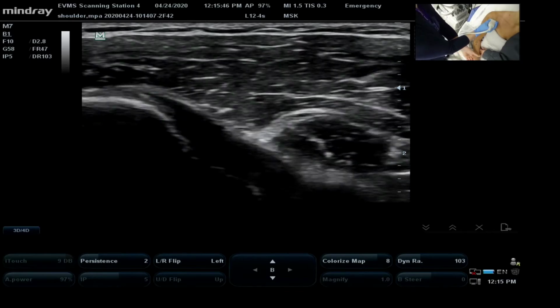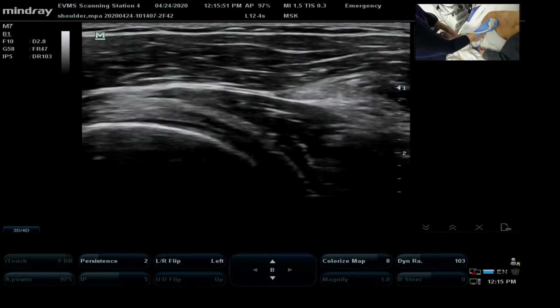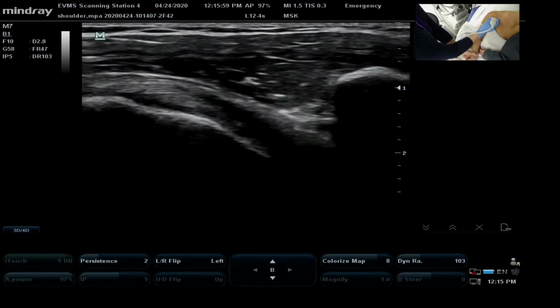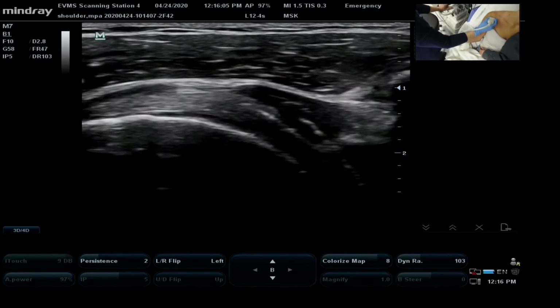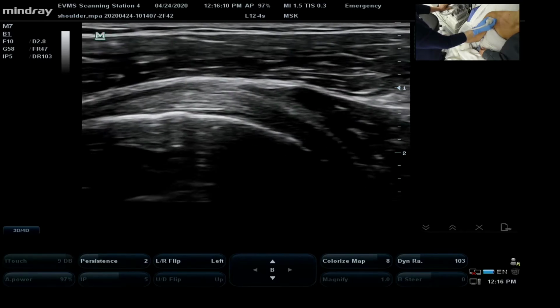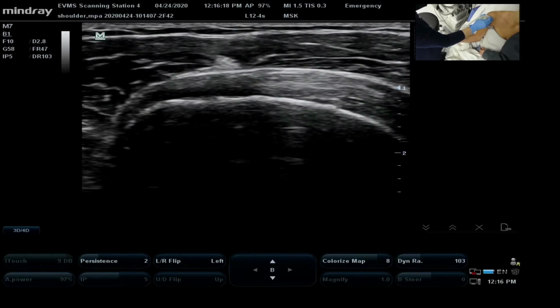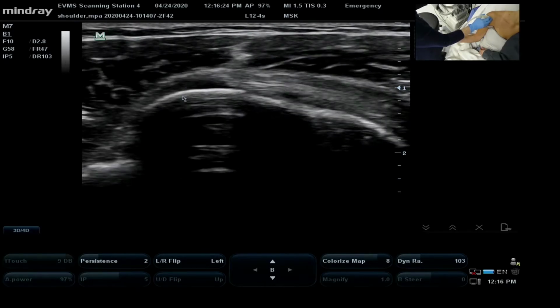And while doing that, we're going to look in this area for any kind of impingement or evidence of bursitis. So I want you just to bring your arm straight out, and you can see the tendon slide easily out from underneath the coracoid, and no evidence of fluid, as I have the patient moving in and then back out to lateral rotation. See right there? And once we do that, we compensate for the anisotropy, and we can see the tendon fibers very well. If we follow the tendon all the way out to the lesser tubercle, we can see its attachment over the lesser tubercle here.